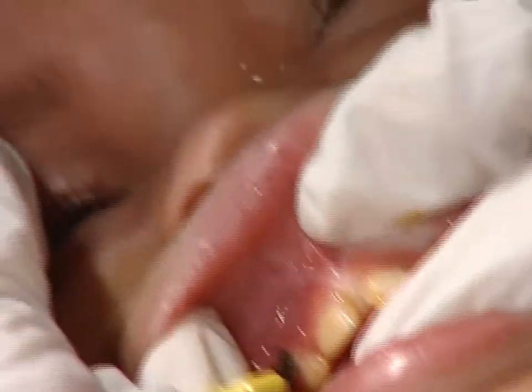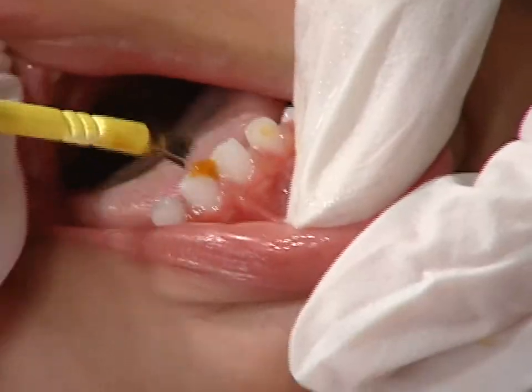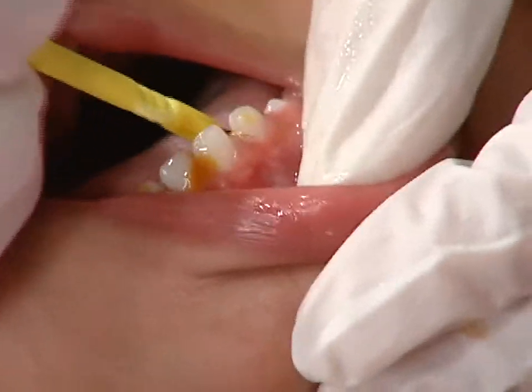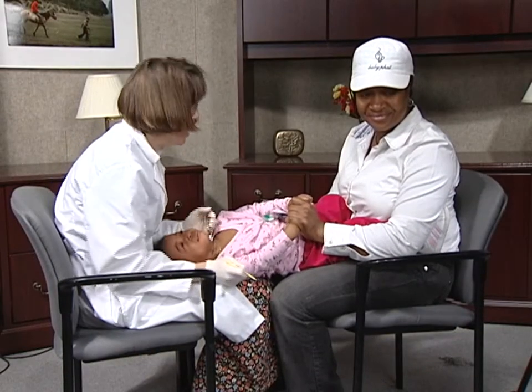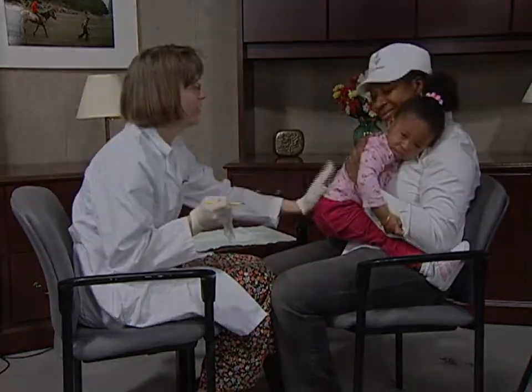We're using Cavity Shield varnish here. Young children often cry when this is done, but this means their mouths will be nice and wide open. Now dry and paint the bottom teeth. Here it would be helpful to use your finger to keep the tongue out of the way. When finished, clean her face and sit her up.